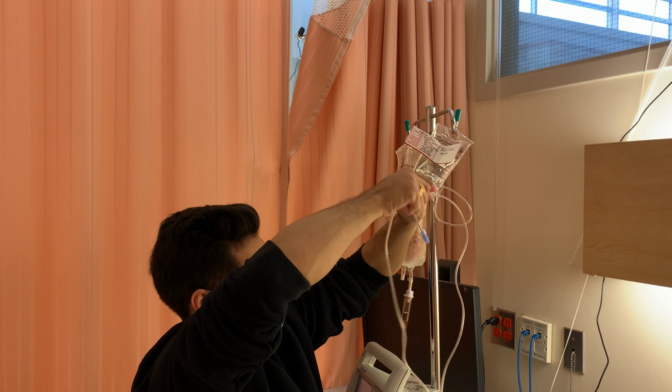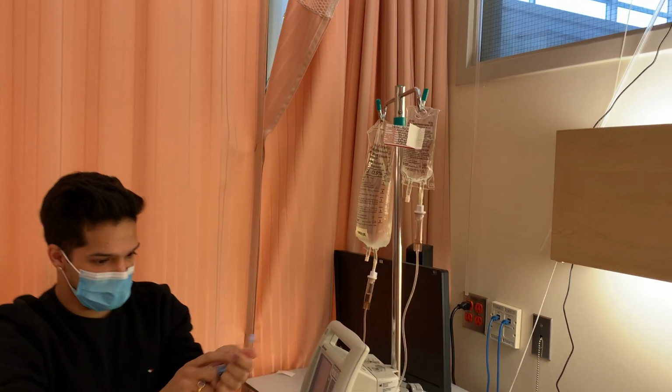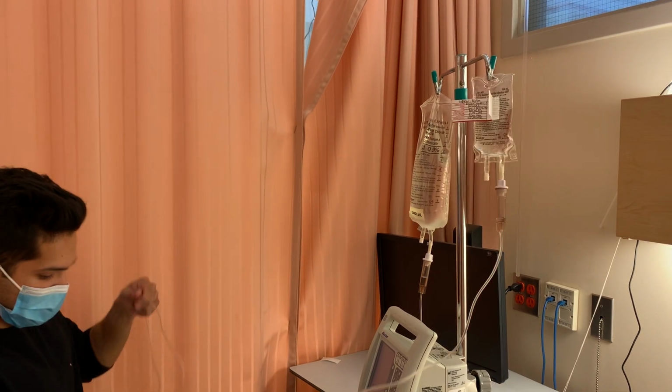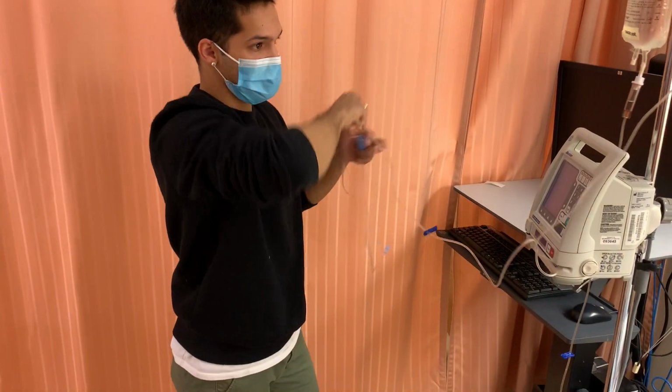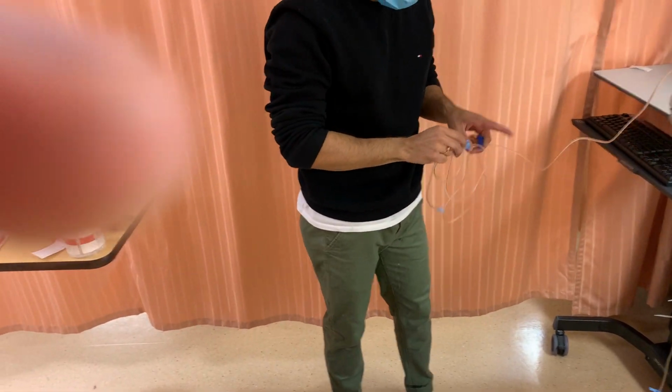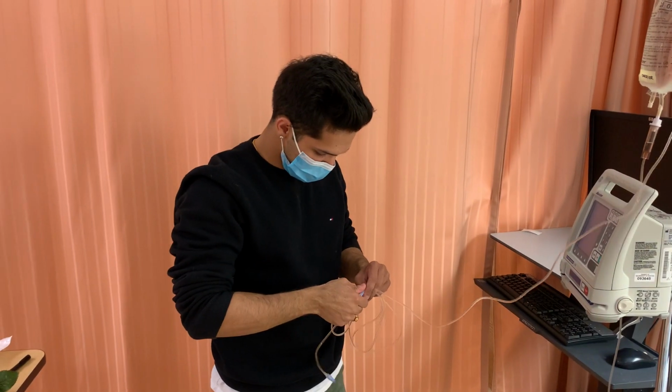I'm spiking it aseptically, perfect. Once I've spiked it, I'm going to pin this cap down and make sure all my clamps are closed. Perfect. Before I do anything else, I'm going to be priming this. I'm going to open my clamps up.